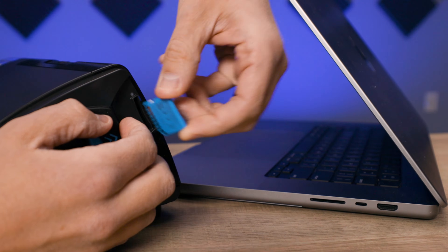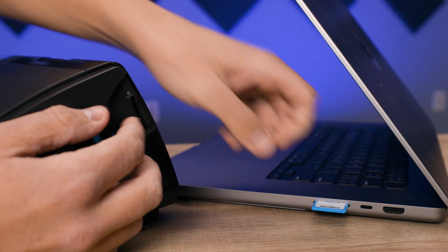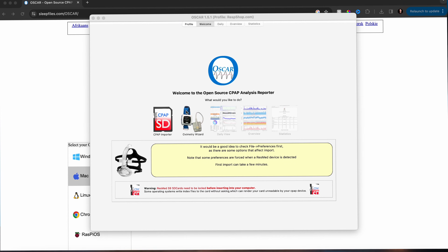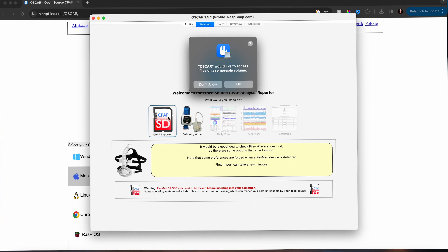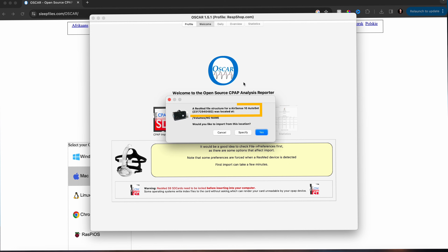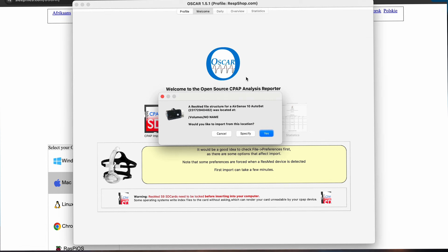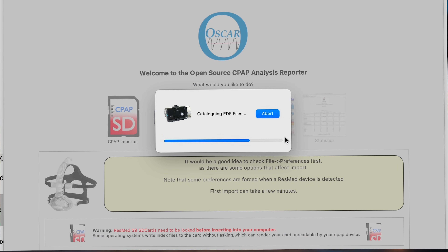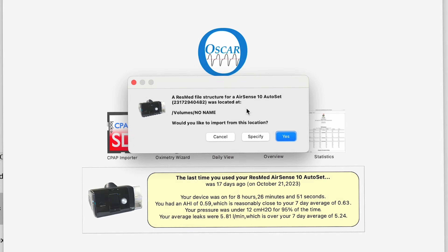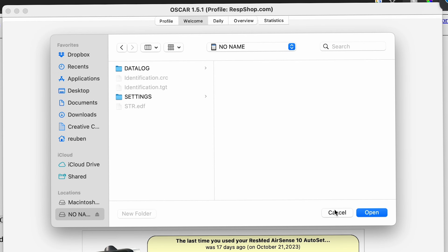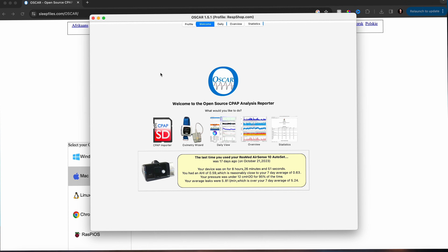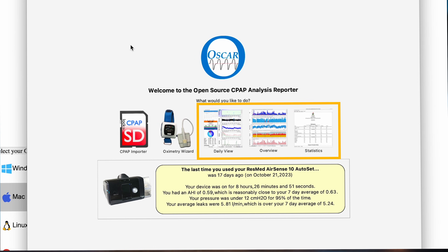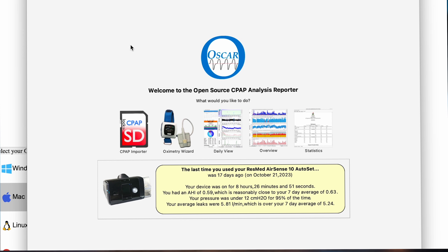With that done, pop the card into your card reader slot on your computer. Back in Oscar, click on the CPAP importer icon. Oscar will probably see your SD card and recognize what machine you're using. If so, click yes to import your data from your card. But if not, click the alternative option to manually locate your card. Once the import starts, it may take a few minutes as this is your first time. But in the future, it will only add the new data and should be much faster. And once the data has been imported, all those grayed out icons about your sleep data will become active, so go and take a look at some of that.